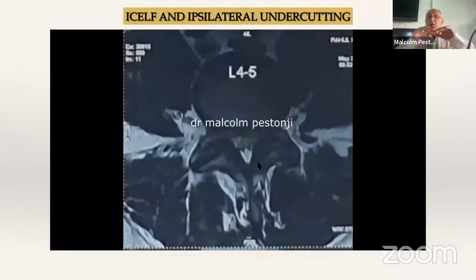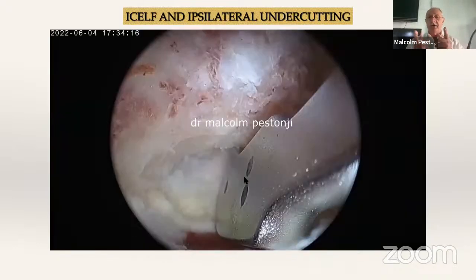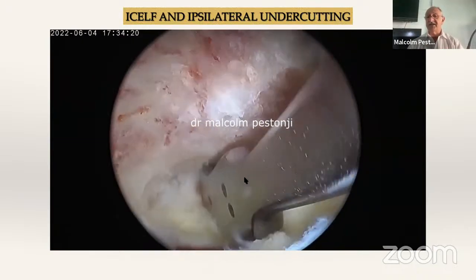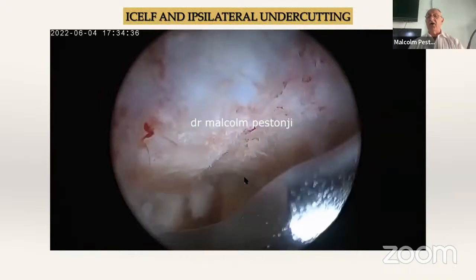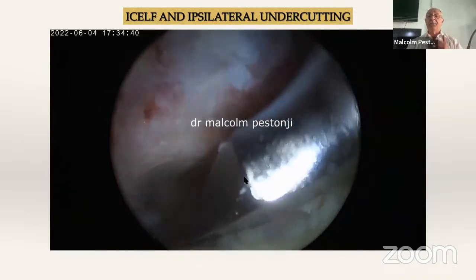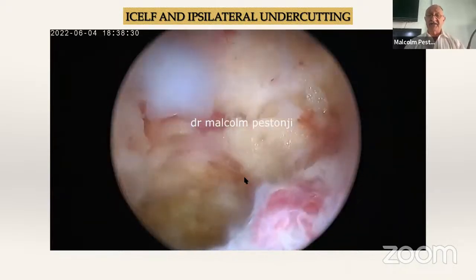Here, I have both foramens closed with central stenosis. So I have to open up both foramens. One I have to do contralaterally, one I have to do ipsilaterally. And I have to decompress the foramen and the cord. So see what we are doing. We have gone extraflavally. This whole thing is extraflaval. I've gone into the contralateral foramen. I've done an osteotomy over there. I'm pulling in this fragment beautifully inside.